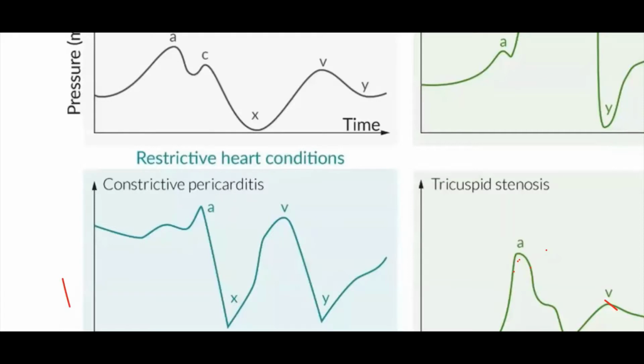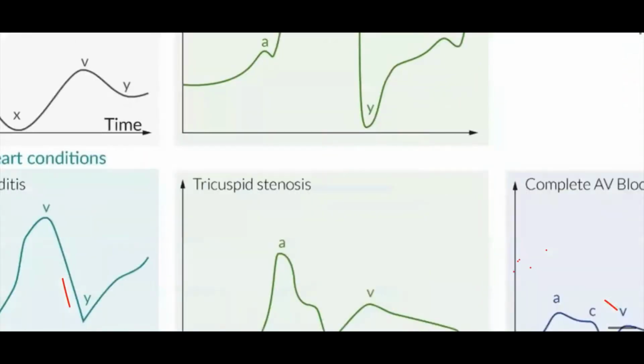This is called the pericardial knock. Sometimes by clinical exam, you can appreciate a hard sound. Knock. Yes, that's the knock. Okay. Now, look at this one here.